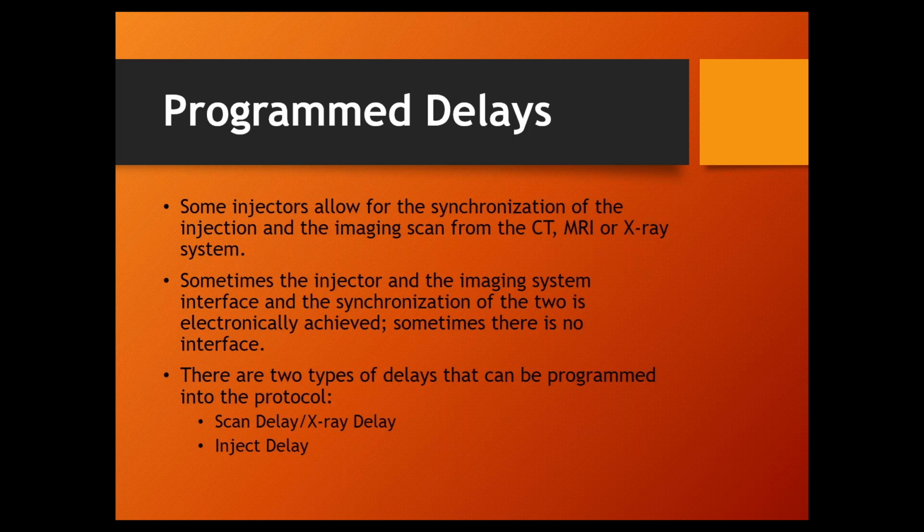So yeah, what makes that nice is the operator just has to hit one button and they both go. Don't have to worry about hitting 2 buttons. So that brings us to our delays. Oftentimes, most of the time, they don't want both imaging and injector systems to start at the same time. They want one to start, give one a head start, and then the other one to go on after that.